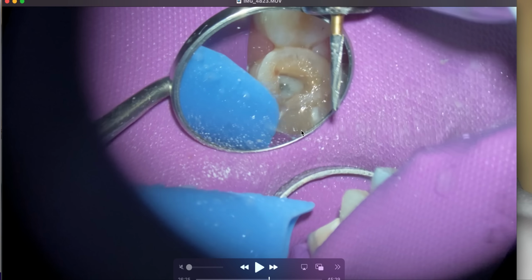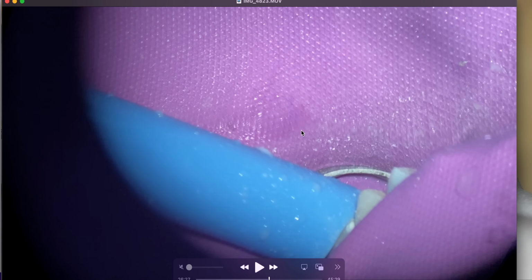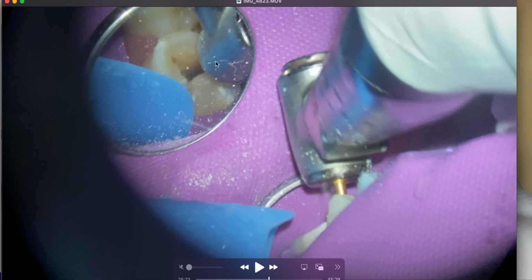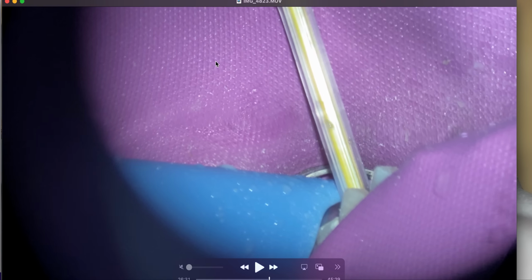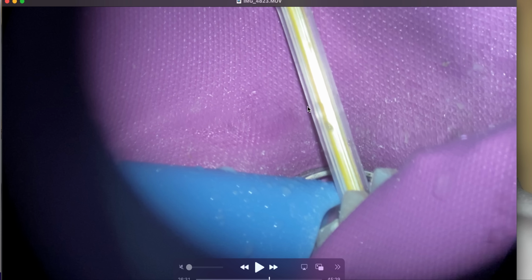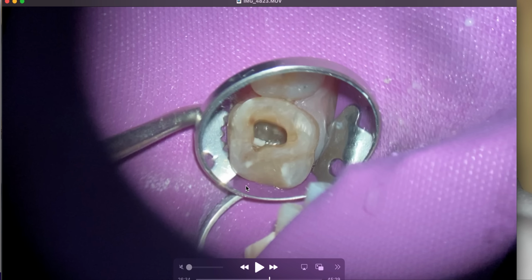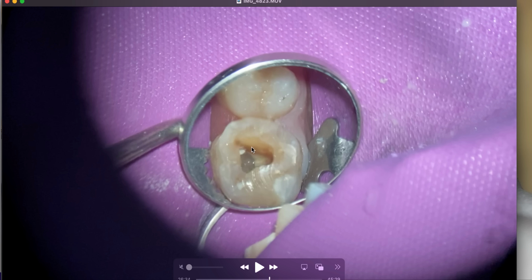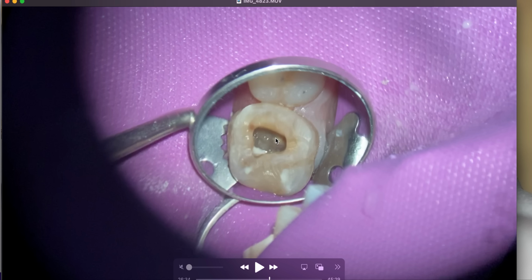What happened was potentially we had a little piece of amalgam in there because right underneath, when I remove this restoration, there's calcium hydroxide. There's no cotton pellet, and I'm actually going to change that. But what happens is she goes to clean the operating area and blows air and water down. And what happened was a little piece of amalgam hid underneath the calcium hydroxide, and then it ended up at the apex. And it was my fault secondarily because I didn't rinse out the calcium hydroxide.